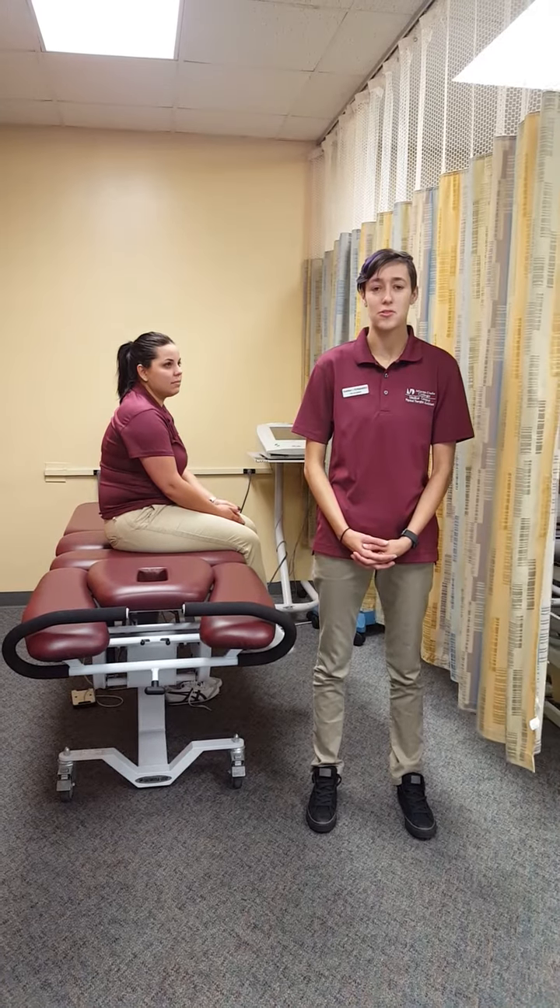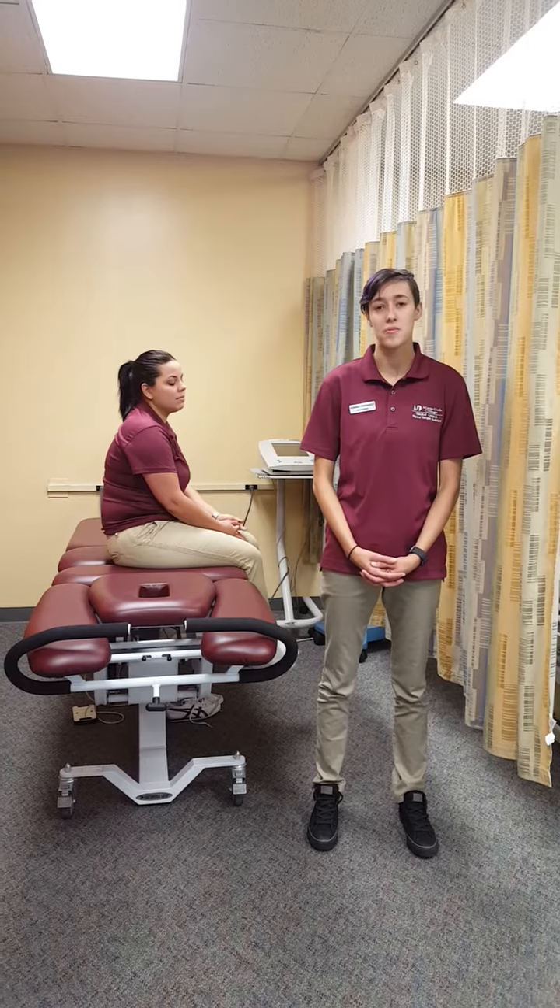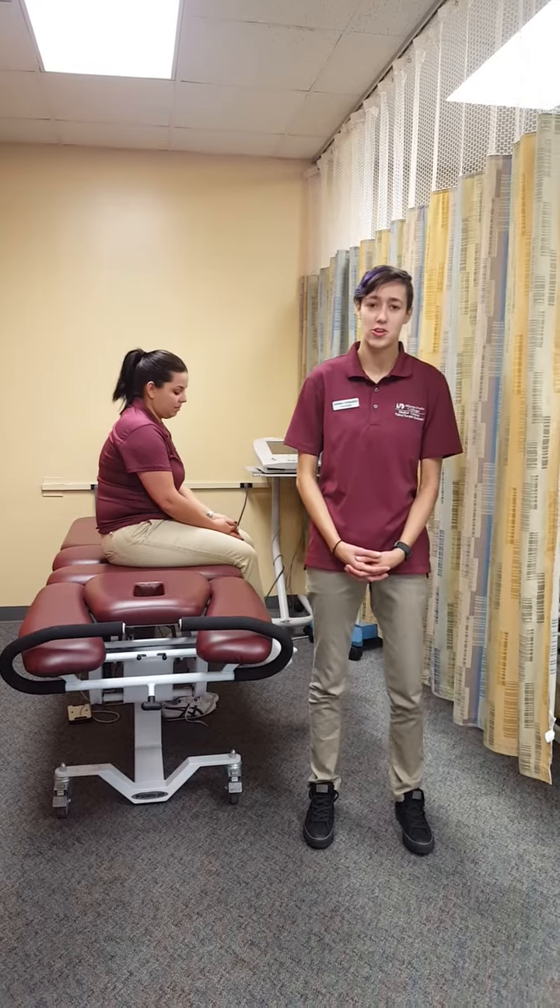I'm Irina Fernandez. I am a physical therapy assistant student here at Miami-Dade College, and today I will be demonstrating how to apply cervical traction.